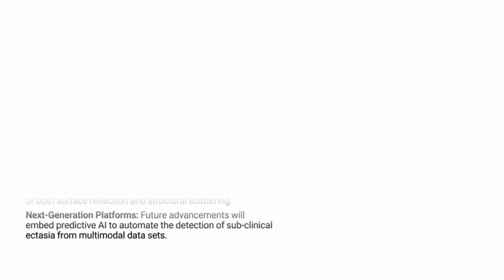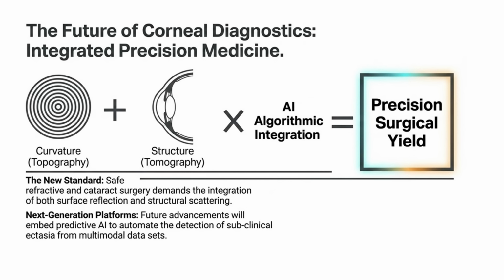The final statement is that the future is for this combination technology, and nowadays they also incorporate AI, artificial intelligence, along with these systems for pattern detection and recognition. And we jump from just detection of the disease to the prediction of the disease. So this is now the gold standard for the future multimodal integrated imaging system.